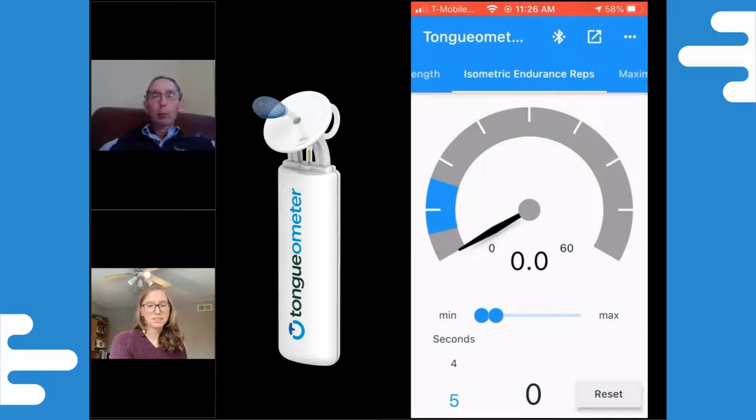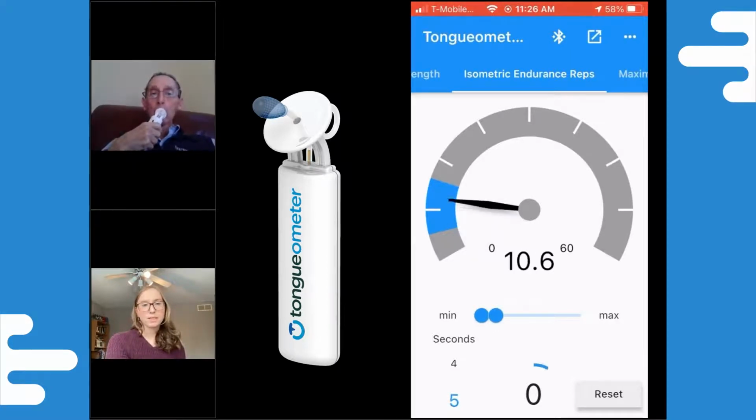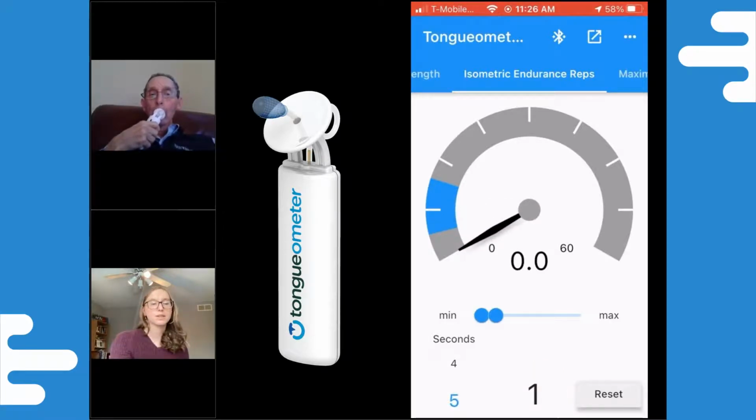All right. And so here you instruct the patient to place the bulb in their mouth, press it against the roof of their mouth, and hold it in that highlighted range for 5 seconds. Once it gets into that highlighted range, there's a blue timer at the bottom that starts counting the seconds. Once he's held it there for a full 5 seconds, it counts as a repetition, which is the number inside of the circle. So now he's at 2 repetitions. And again, you can assign the number of repetitions that you feel is appropriate for that patient.